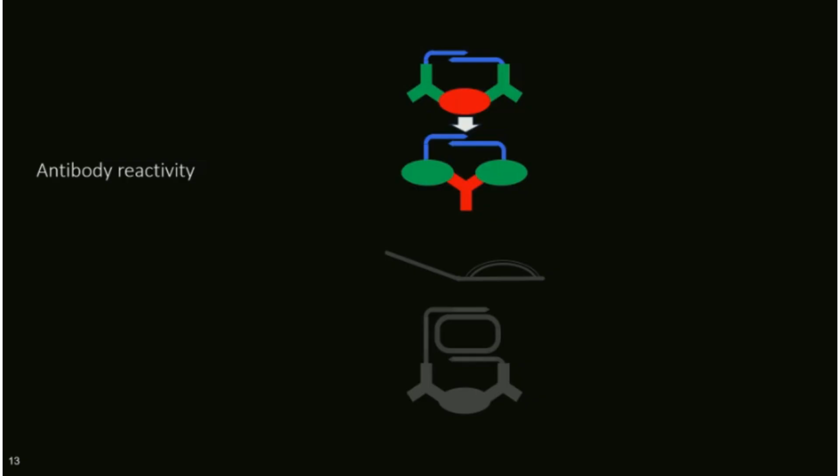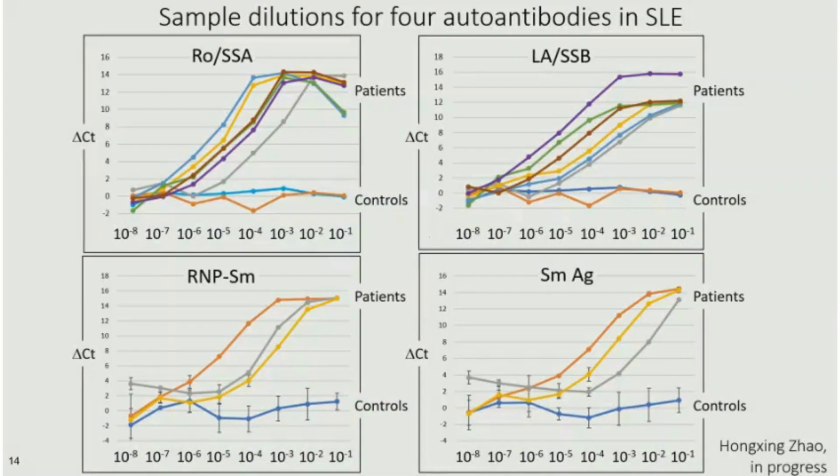So what we're after is antibody specificities. Of all the things that you can measure in blood, what antibody specificities you carry around is one of the more significant ones. It tells you if you have an autoimmunity, it tells you if you're properly vaccinated, what infections you have suffered. So using the very same format, we can do this.